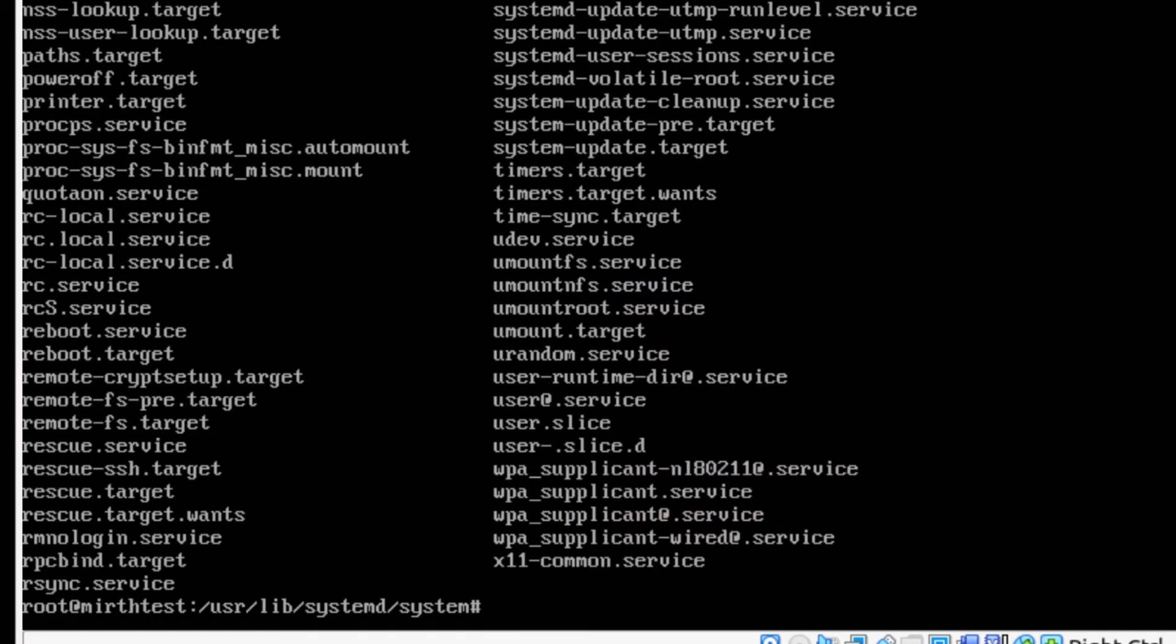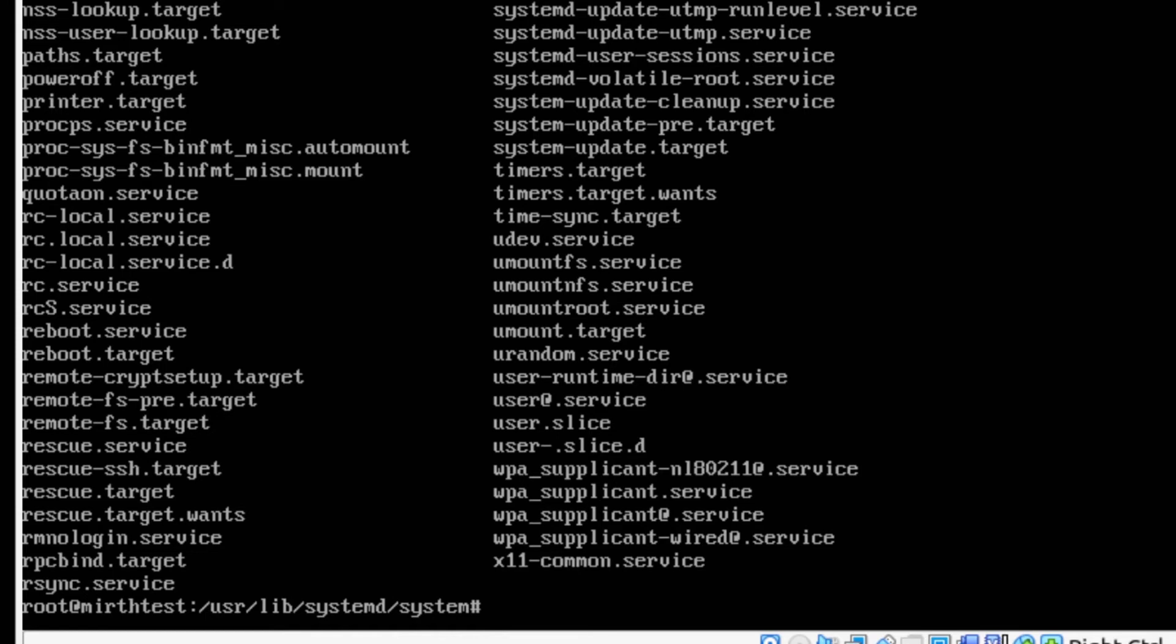If we do ls you can see there's a whole bunch of files in here for all different kinds of things. But we don't need to worry about those. What we want to do is take our MIRTH Connect dot service file and just add it to these other files so that it'll be executed the same way.